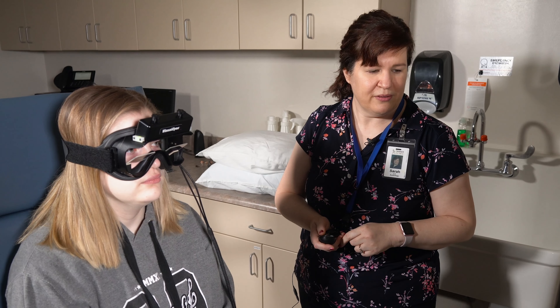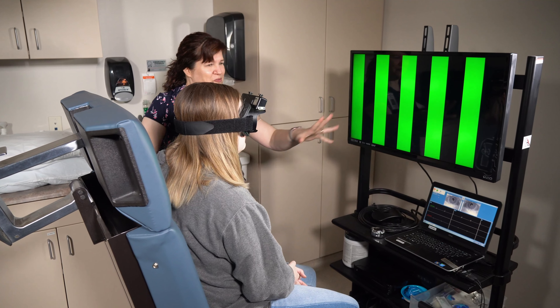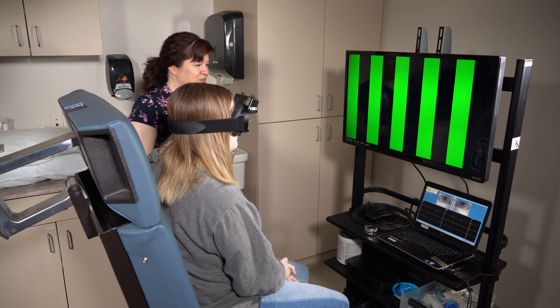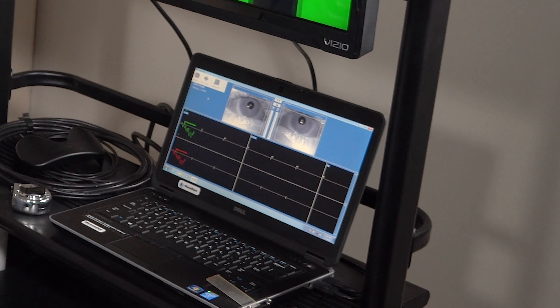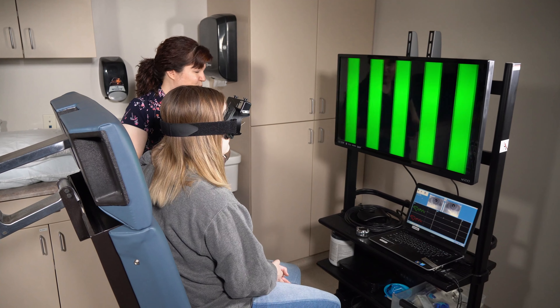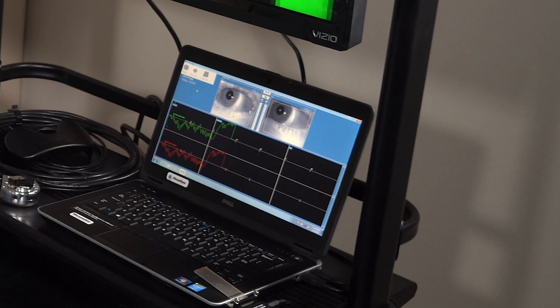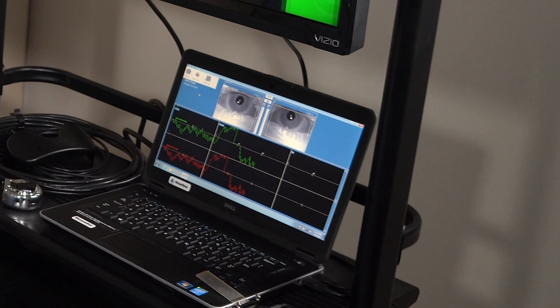You're going to see these stripes moving from one side of the screen to the other. I want you to count them in your head as they go by — don't say it out loud, they're too fast. They're going to switch direction in a couple seconds. Keep it up, count them in the middle of the screen. I can see your eyes — perfect.